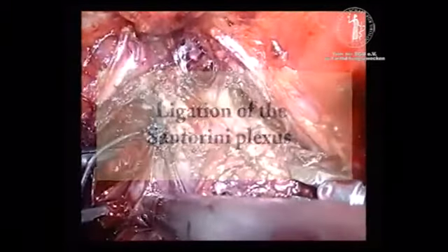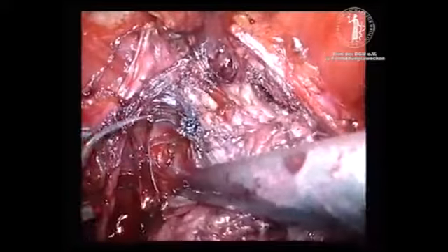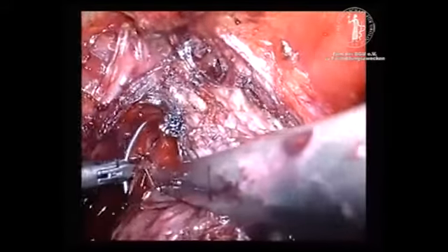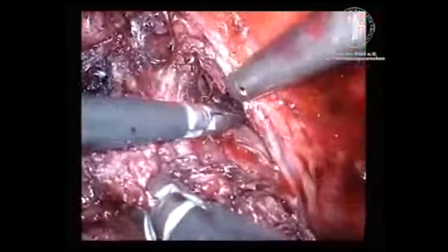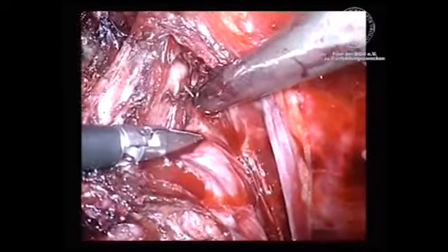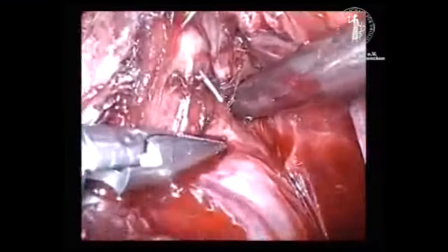After full mobilization of the apex of the prostate, the Santorini plexus is ligated. A 2-0 Polysorb GS22 slightly straightened needle is used and guided from left to right in the plane below the dorsal venous complex, and the plexus is thus ligated.